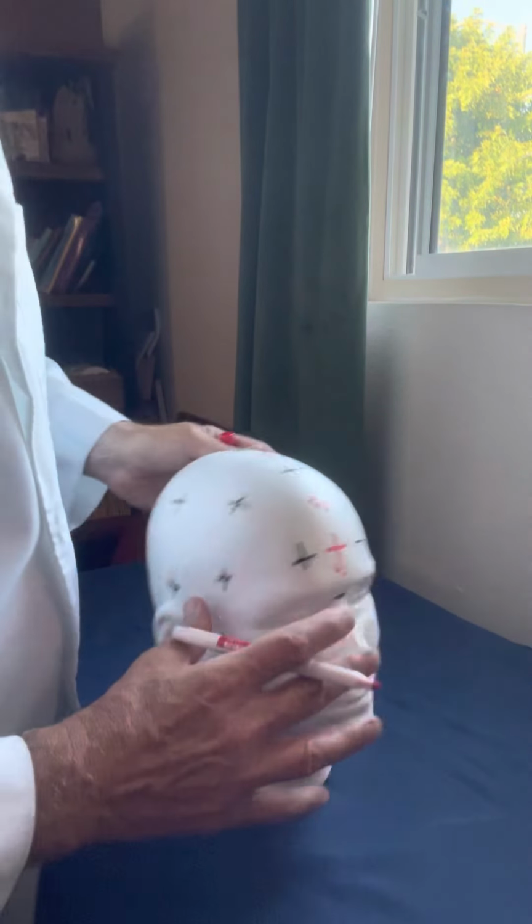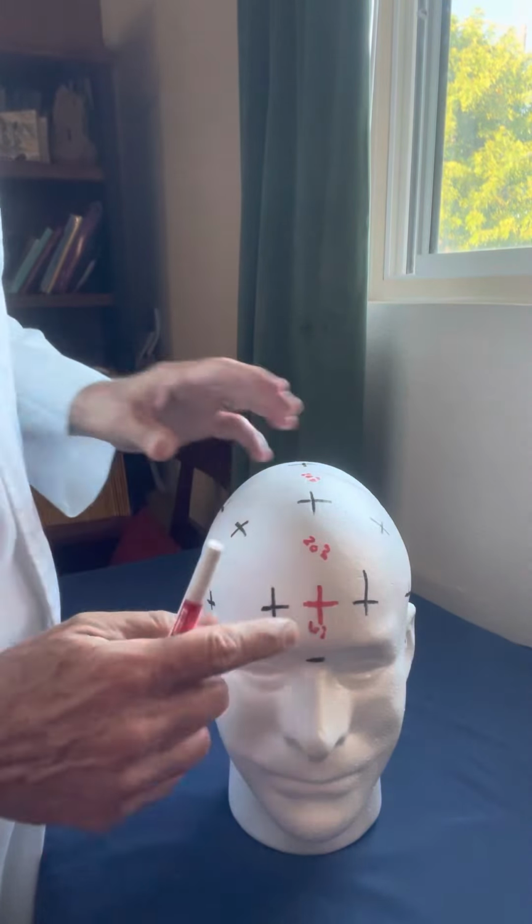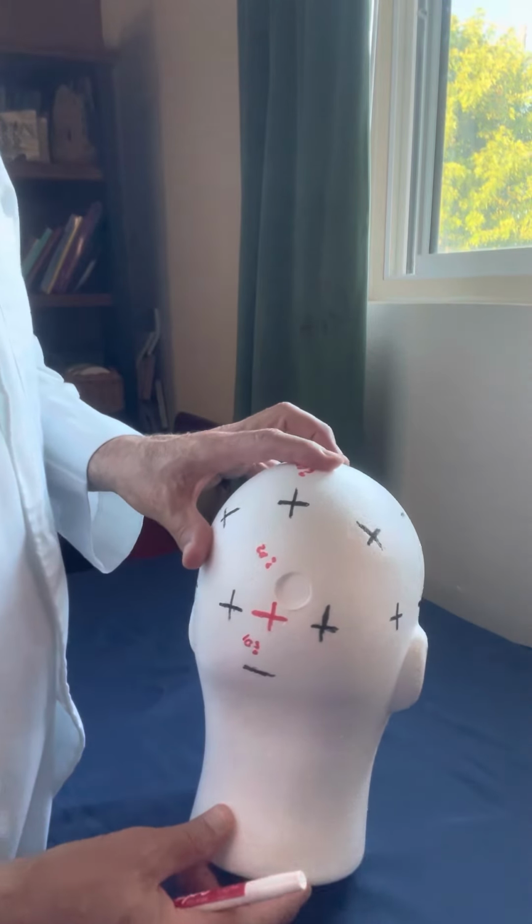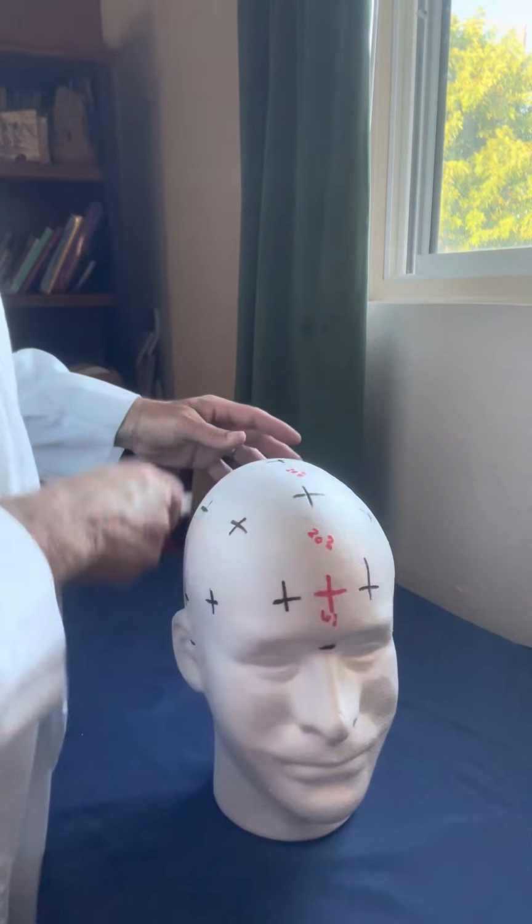Okay, so that's the sagittal plane. If you add all those up, 10, 20, 20, 20, 20, and 10, that's 100% of the nasion to inion distance.